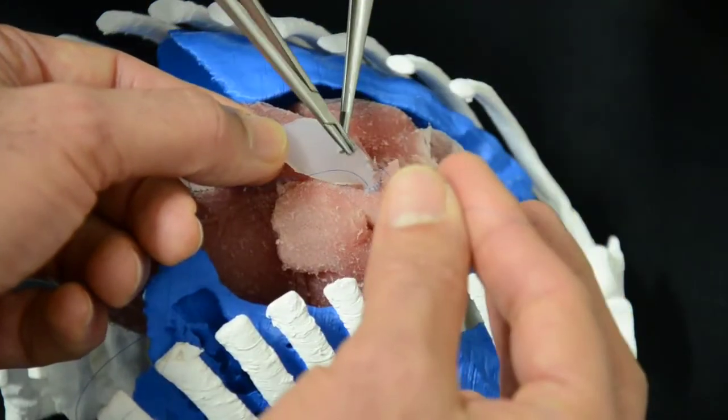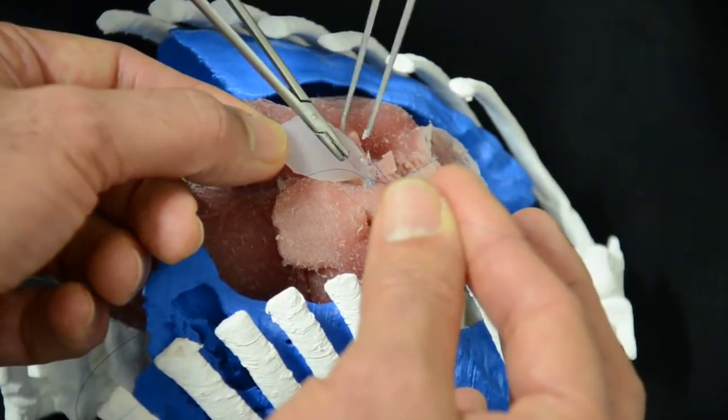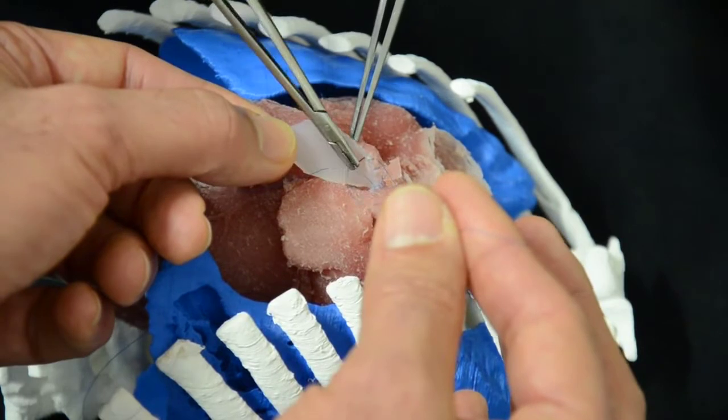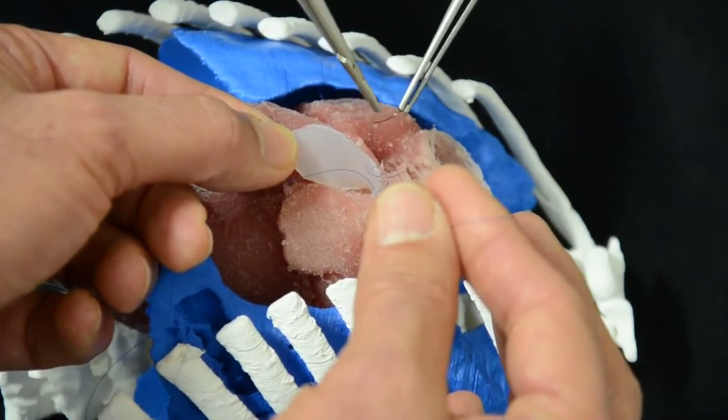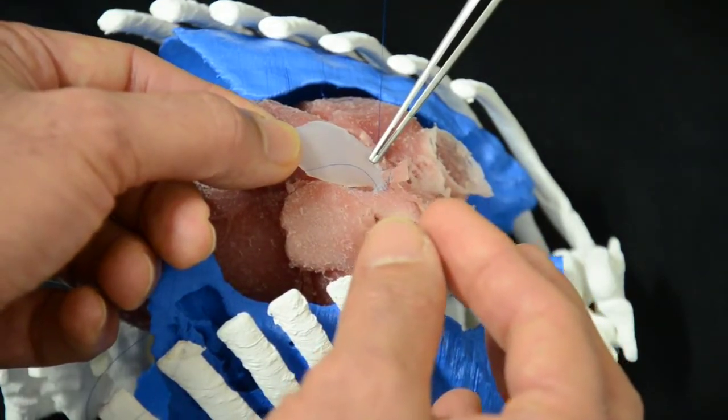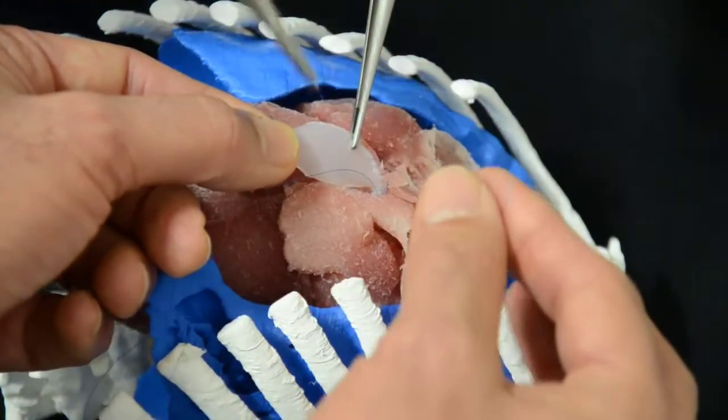As you can see, that's a good way to train in which the space in between each suture is exactly the same, and the distance to the edge is exactly the same. That is perfectly demonstrated.